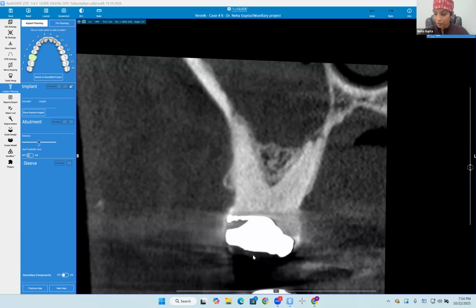Okay. And any pointers on extracting it so I don't end up messing up the buccal and lingual palatal walls? To be honest, Doc, it's inevitable. There is no lingual plate, and the buccal is not going to have much left on this. Yes, Doc. Unfortunately, that's what happens when you have roots that are diverging like that.